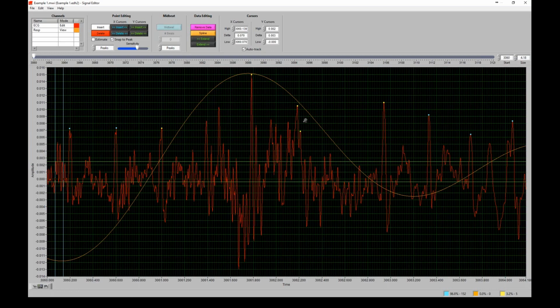And that is just removing the beginning of this segment where this noise exists. And we can do that because we're looking at 60-second segments. So remember, the other rule that we talked about was we need to have at least 30 seconds of contiguous data to accurately measure something like RSA or high frequency heart rate variability. And when we look at a segment that's as low as 30 seconds, well, we can't remove any data, because if we did that, we'd be exceeding that threshold and we couldn't report those values.